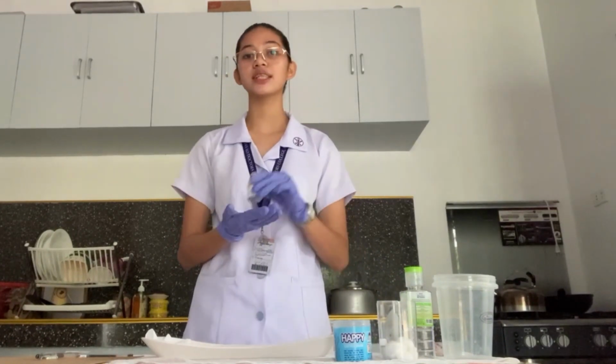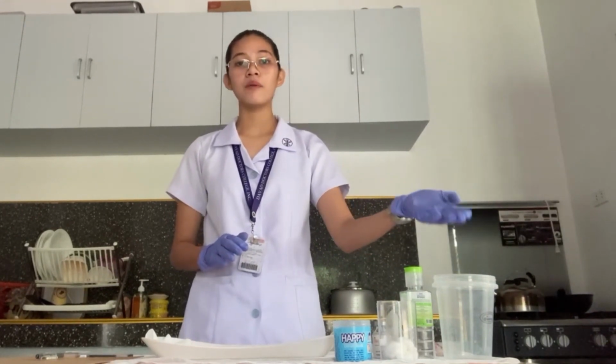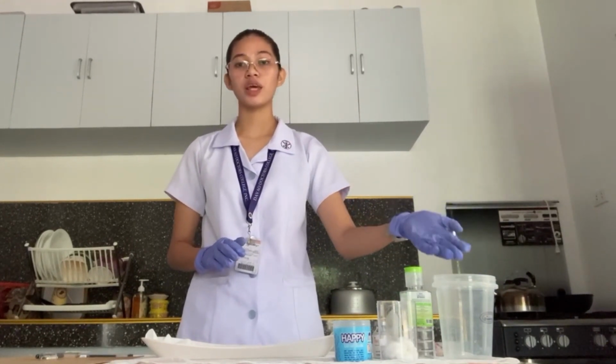Then we have our sterile water in the vial. This will serve as our medication for today's demonstration. We also have our waste receptacle. This is where we dispose all of the used needle to avoid the pricking of our finger.